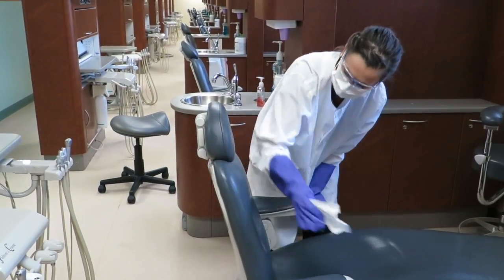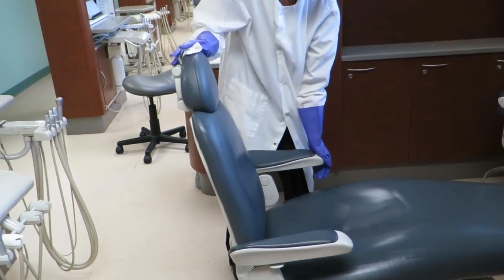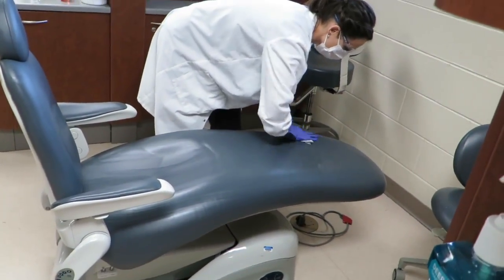Each clinician will go in a different order when disinfecting. It is important to have a routine and be sure to clean in the same direction every time so you can ensure no surfaces have been missed.